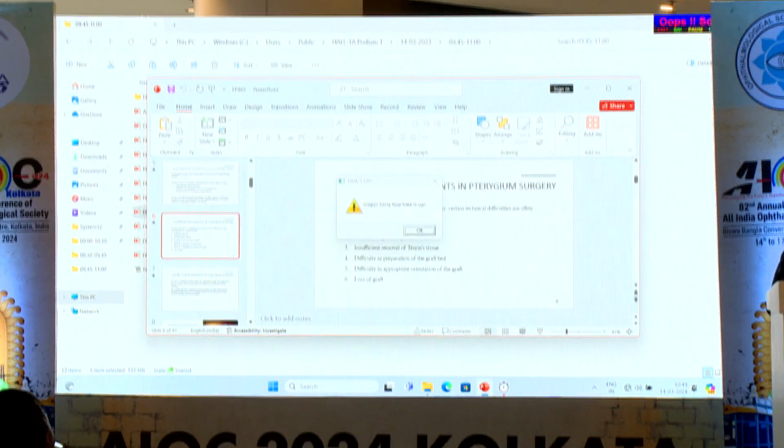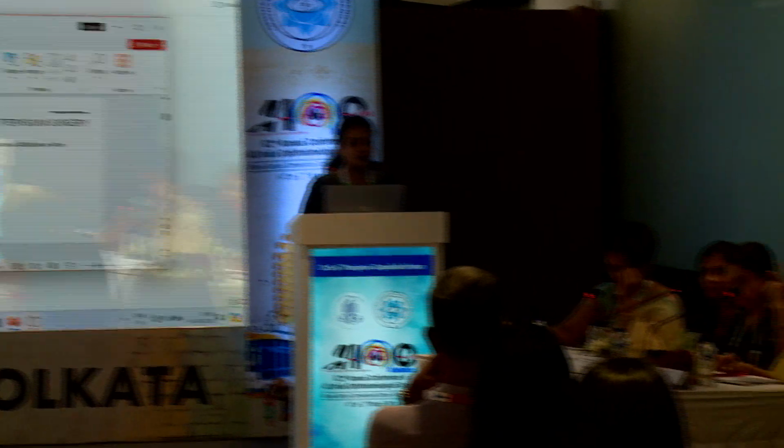Yes, a very quick comment. The process was very well documented. I take one exception to one step. I will not recommend an epithelialized surface being tucked under another epithelialized surface. In the long term, you will have the problem of epithelial inclusion cyst. If you really want to do that, the periphery of the conjunctival graft that you are taking should be de-epithelialized before tucking. That makes the surgery a little more complex.